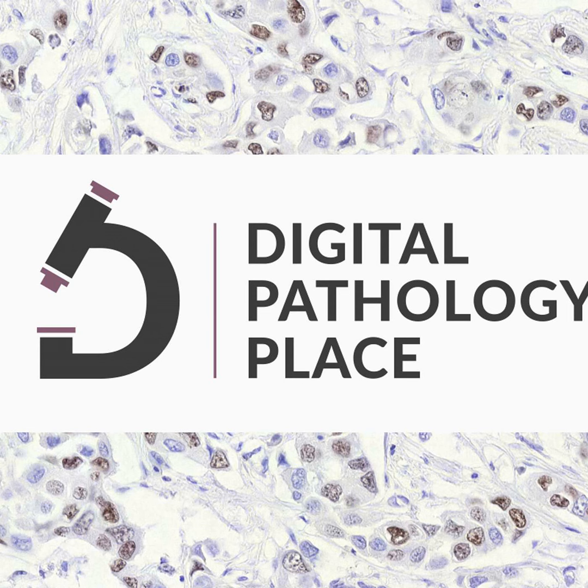And not surprisingly, there is high discordance among pathologists. We know there is always high discordance. This is like the placeholder sentence that everybody is going to have in a paper about AI and pathology. The pathologists are discordant. Well, yes, they are. But this is still an amazing job that they are doing. But if we can have a tool that helps us, fantastic. So there's high discordance among pathologists assessing those SNB, sentinel node biopsies, for positivity, which may lead to false staging.